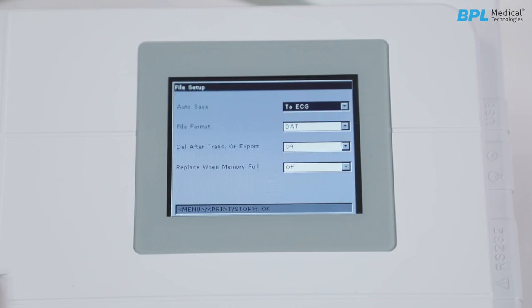File setup. Auto save has three options: to ECG saves automatically to the machine; to U disk saves to USB if connected; and off does not save the ECG record. File format — DAT and PDF are standard. SCP, FDA and DICOM will be enabled only on request at time of purchase. There is also a delete after transmission or export option.